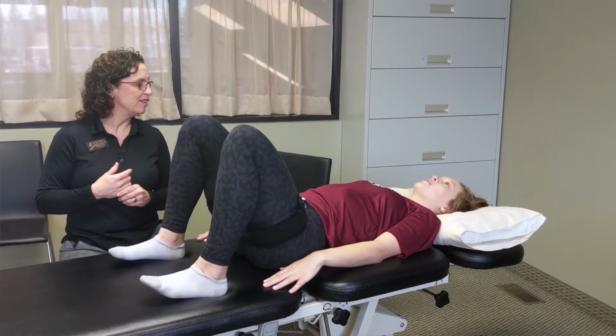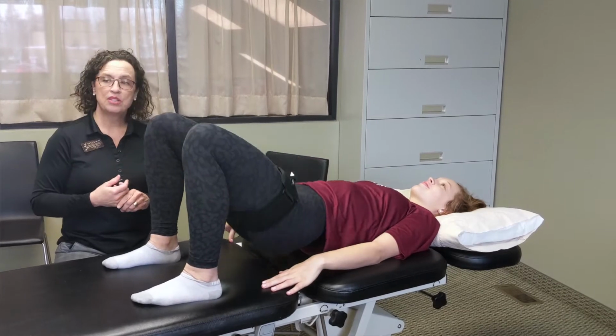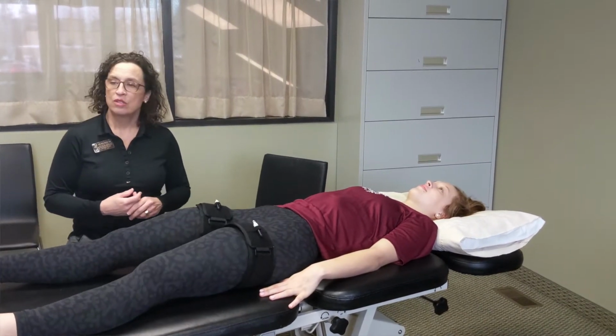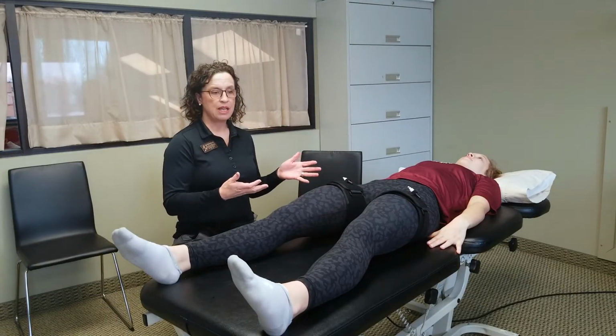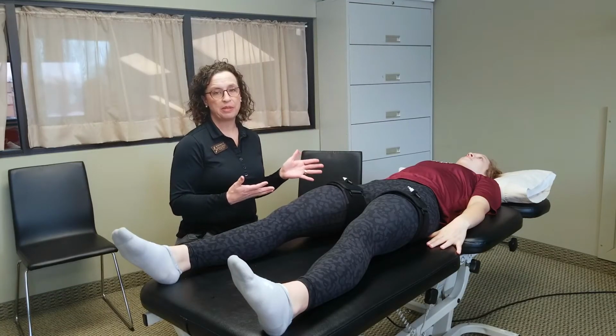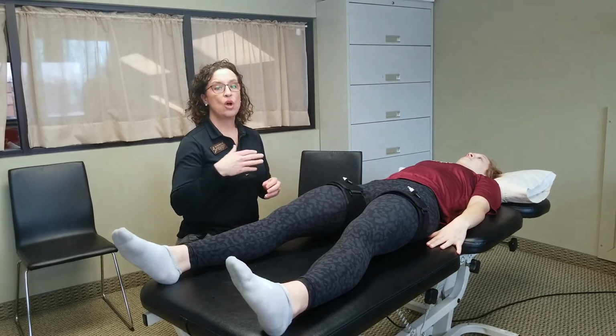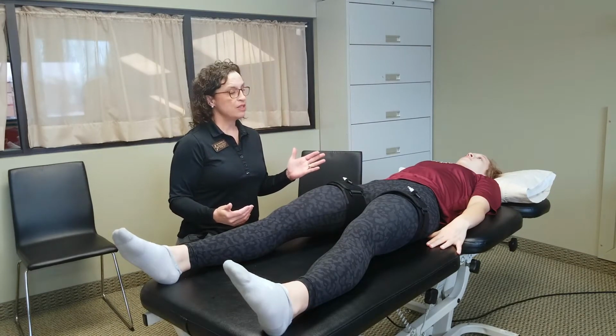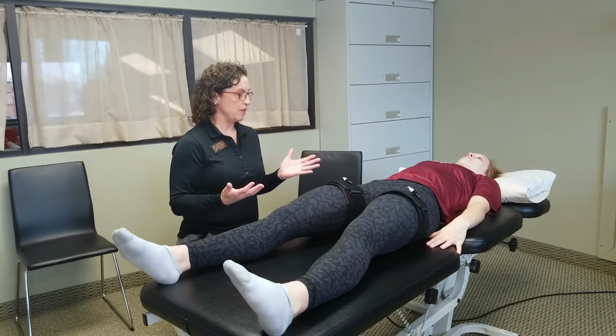How are you doing? One more. One more. Okay, now Rachel's going to take a 30-second rest. So this is a bridging exercise. I would say for an athlete, they would probably consider it on the low intensity side, not the high intensity side. And so why would we have Rachel do this?